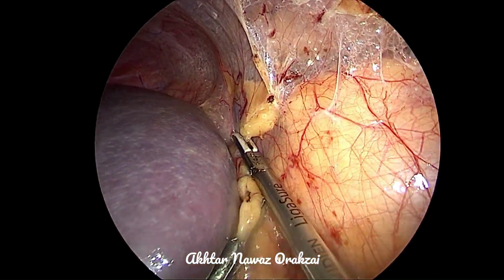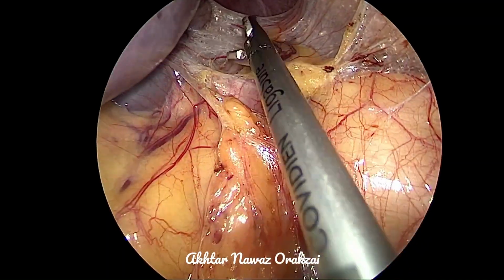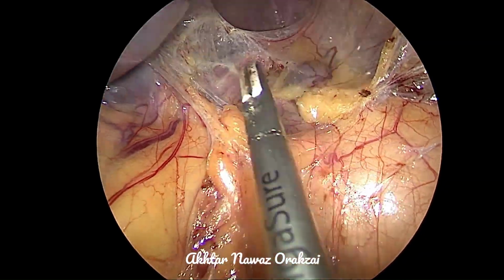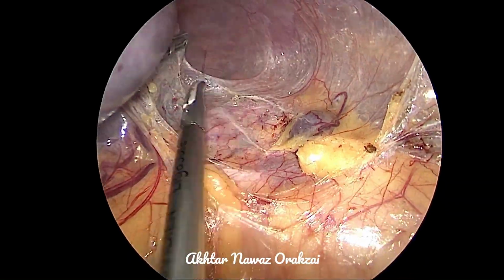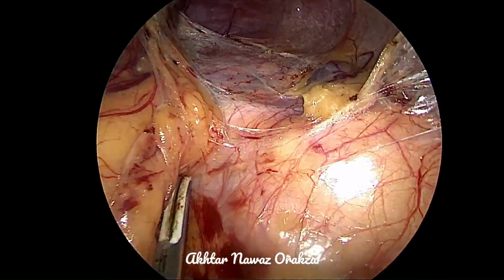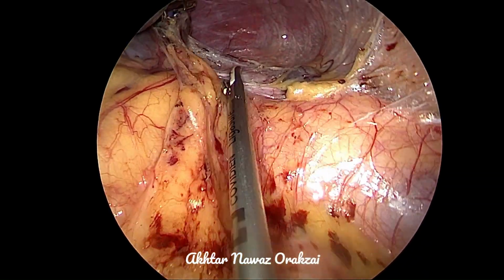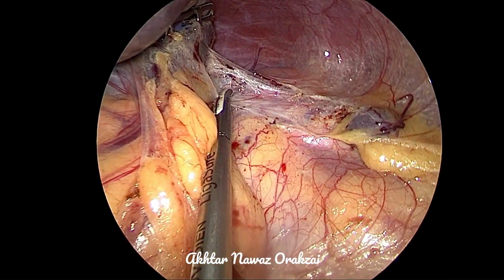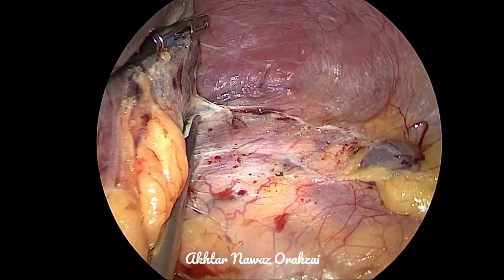I would answer this question with the comment that I usually call this step the homework. And if you do the homework by making the field as much clear to yourself, the final steps of the procedure will be extremely easy. So a little bit of hard work here can save you a lot of time at the end of the procedure, and also it can make the procedure extremely easy.